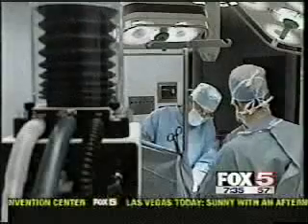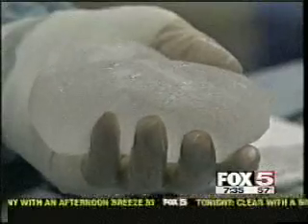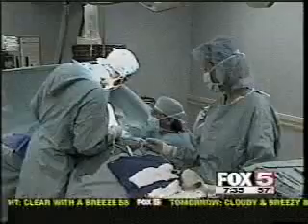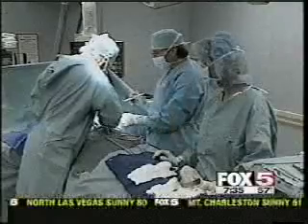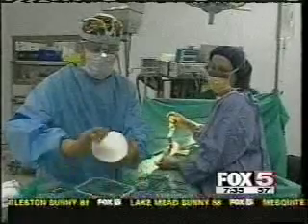Traditionally, they've been put on top of the muscle. In my hands, I usually use the saline implants, usually put them underneath the muscle to try to get a little more soft tissue thickness, try to mask the upper pole that you may see some folks walking around with. So it really is dependent upon the individual and what you want to achieve for that individual.